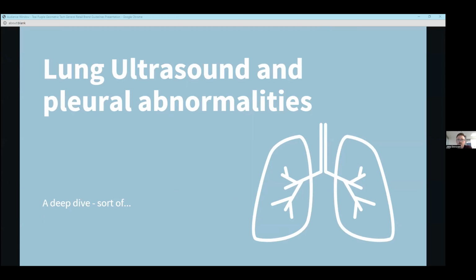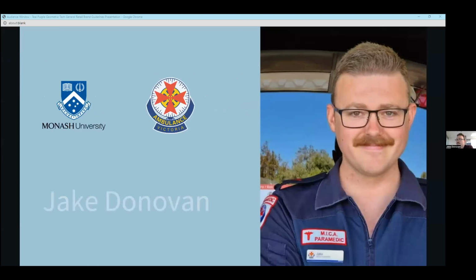So I just want to start. Well, today I'm going to talk to you about lung ultrasound and pleural abnormalities. I've titled it a bit of a caveat, a deep dive, because this turned out to be a much more complicated topic than I expected it to be. Most of you know me by now. I'm Jake Donovan, local MICA paramedic and PhD candidate with Monash University, looking into ultrasound utility for paramedics in the out-of-hospital setting.